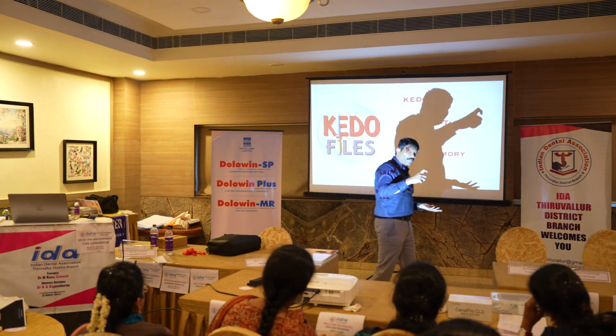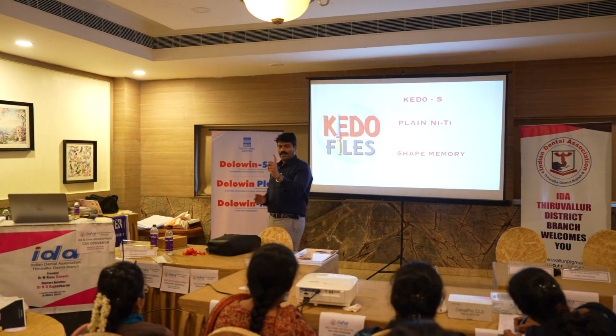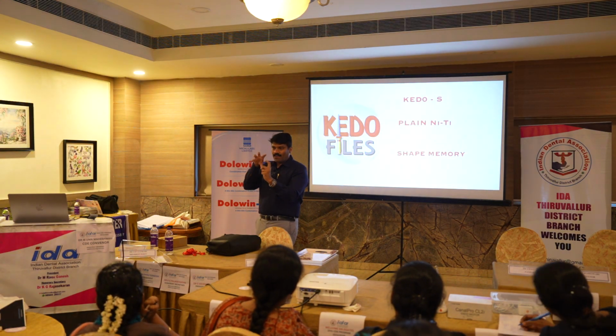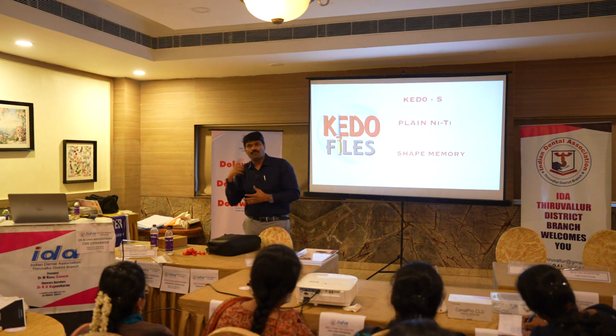When control memory is there, fracture reduces. Shape memory files will have aggressive preparation and will fracture more compared to control memory.